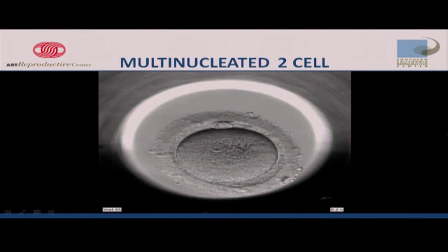All right, so this one, in a second, what we're going to do is show you how an embryo shows you multinucleation, an abnormal nuclei within an individual cell. There's going to be more than 1 nucleus in a cell at the 2-cell stage when he plays it in a moment. You'll actually see there's multiple clearish areas. That's telling us that it has not put the chromosomes together in the correct way. It has not aligned everything correctly. It is not prepared in order to duplicate and segregate the chromosomes normally. Most often, this leads to a significant decrease in the percent of implantation for an embryo. It usually cuts it by more than a half, if not completely eliminates it.